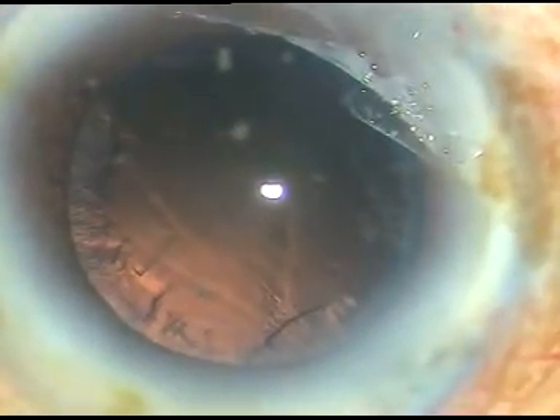If the apex goes down towards the posterior capsule, it presses at a point. The last bit of this hard nucleus is taken out, and I have been able to conquer this cataracta nigra. I am very happy.